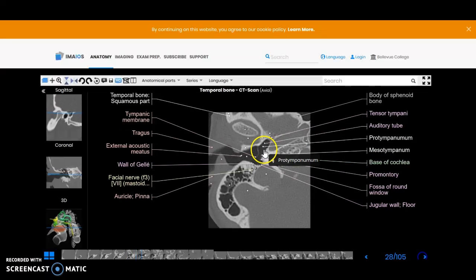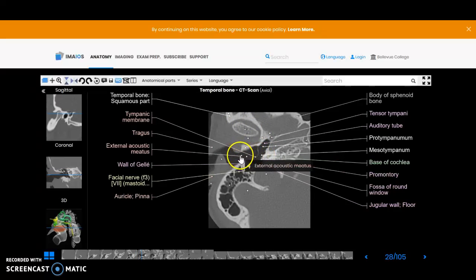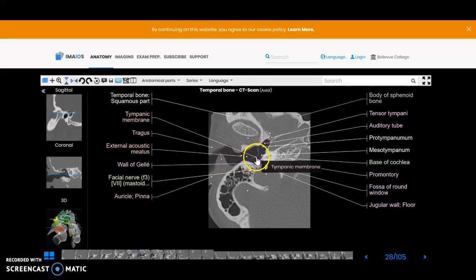And then there's another nice shot of the TMJ joint and the external auditory meatus and the tympanic membrane.